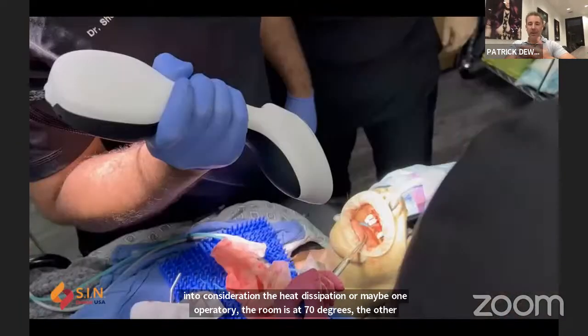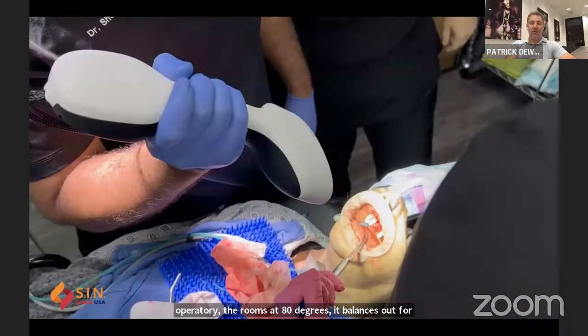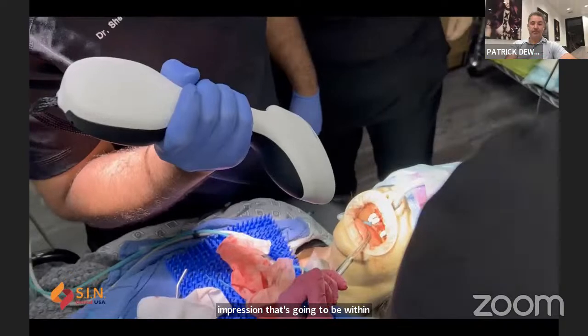Here's the micron mapper. This will give you a real-time example of how long it takes to capture a digital impression. That's going to be within 15, maybe 20 microns in worst case.